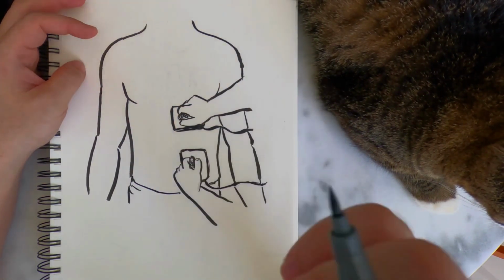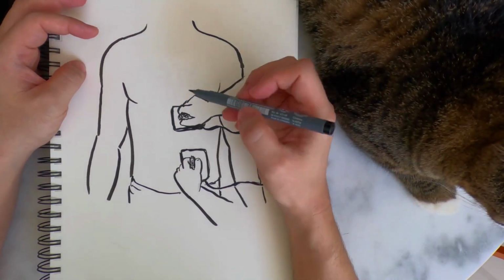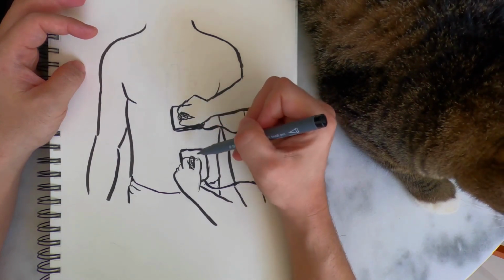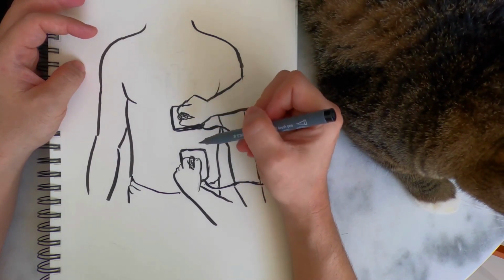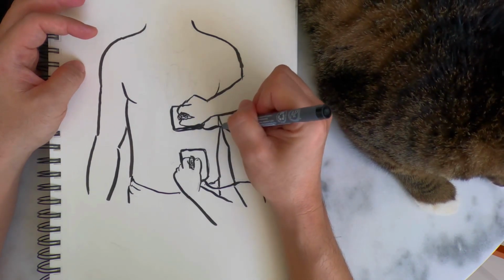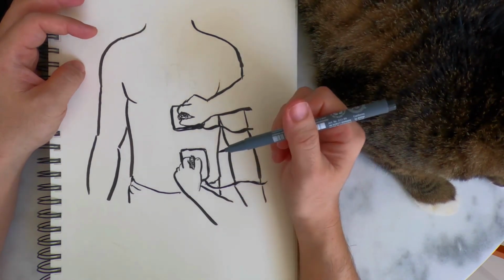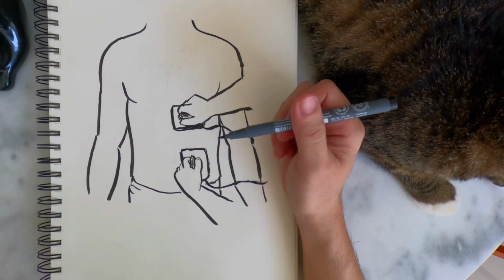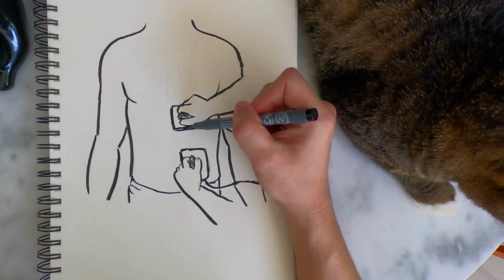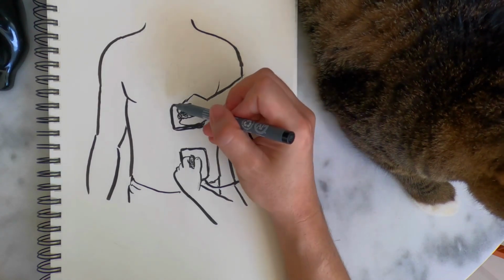Sometimes we attach pads to monitor the heart's rhythm, known as red dots, which are round stickers placed on the chest. If we attach 3 or 5 stickers and connect them to the heart monitor, there might be metal components in those stickers. If we place a pad on the right side and then press the shock button, we might risk shorting out something. Therefore, we avoid this method.